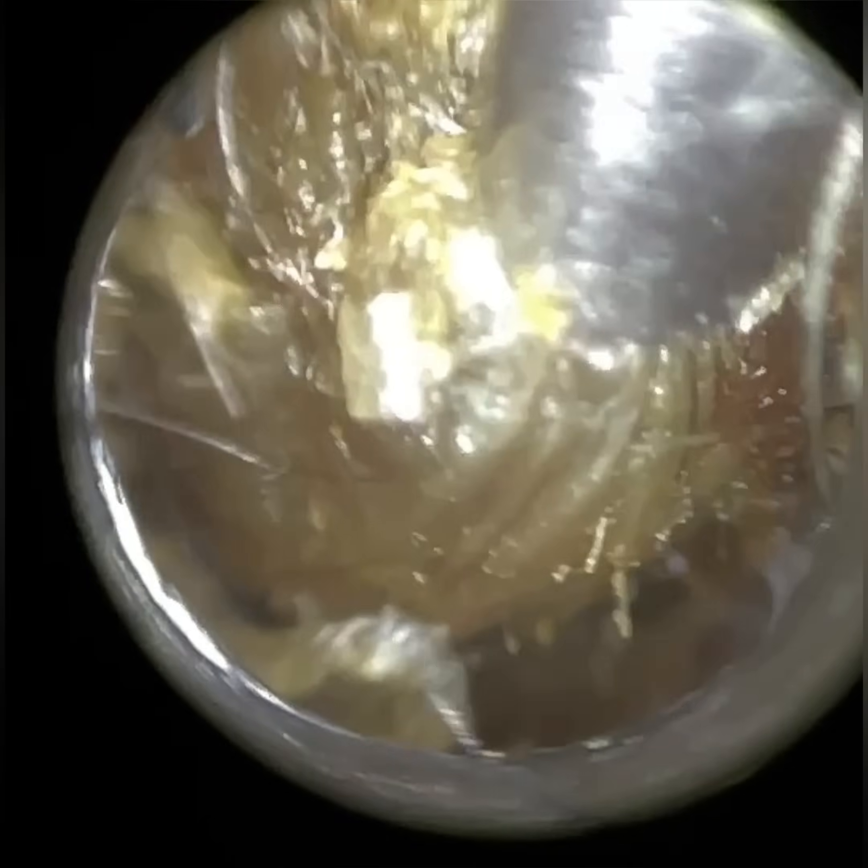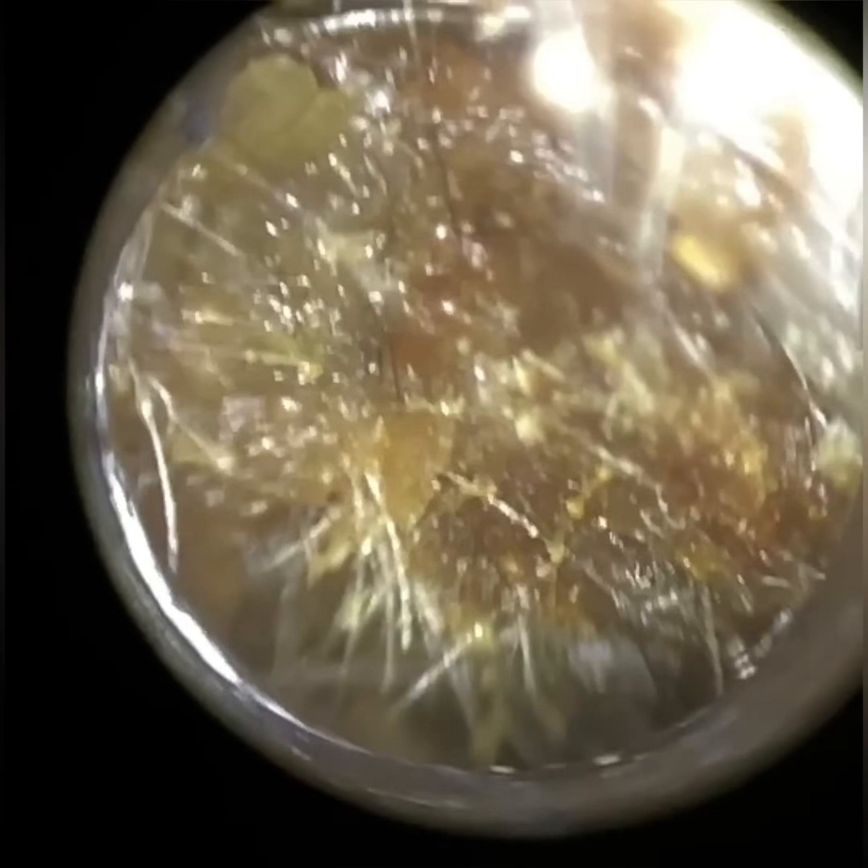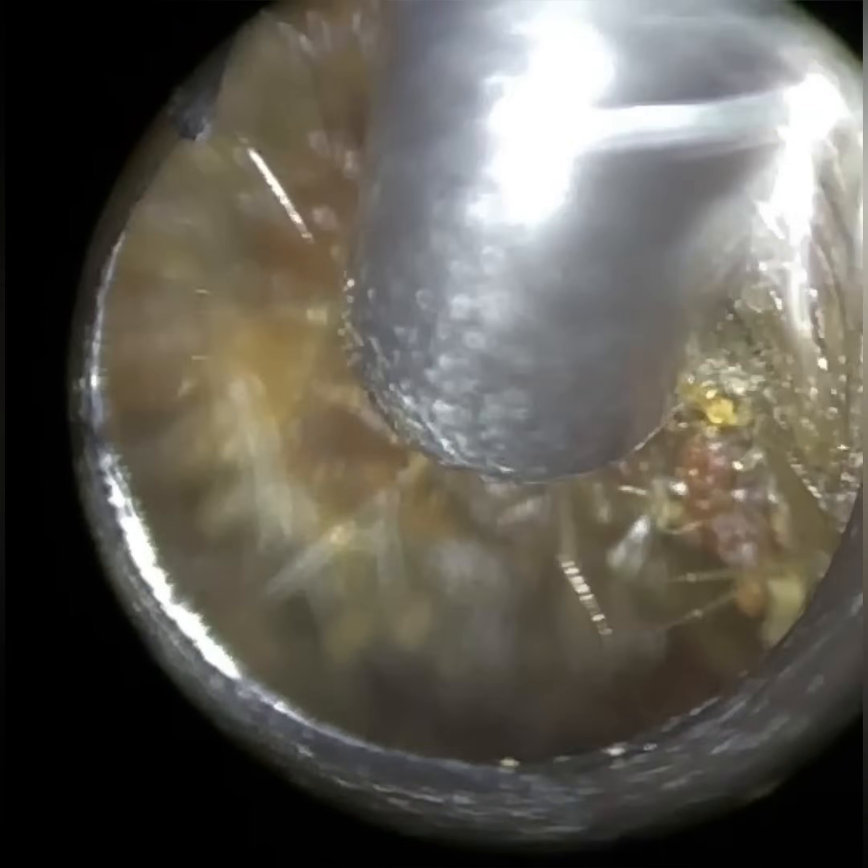We have a smaller size speculum as well for more narrow paediatric ears, with an internal diameter of 3.5mm. And all of our speculae — there are two larger sizes, a 5mm and a 5.75mm. All of our speculae have a flared proximal end, so it stops you from over-inserting into the ear, and an opening at the top which assists with insertion of the instrument.